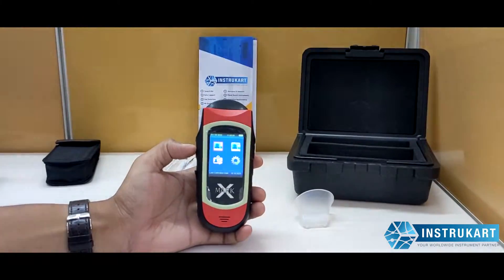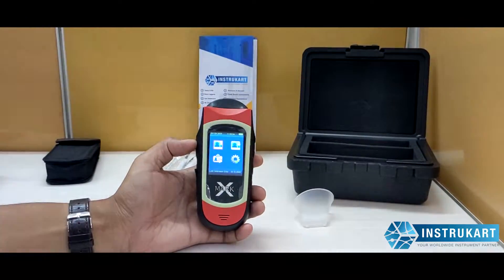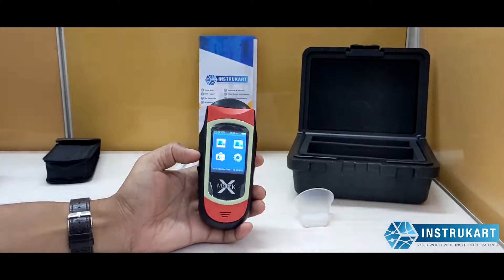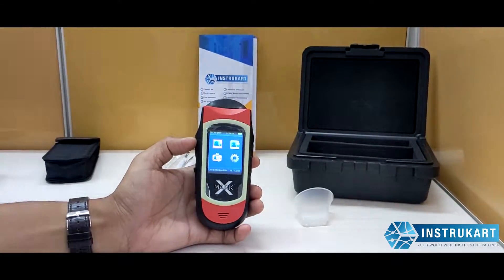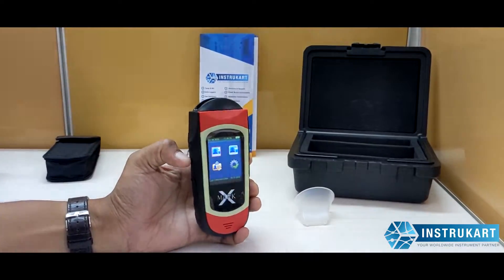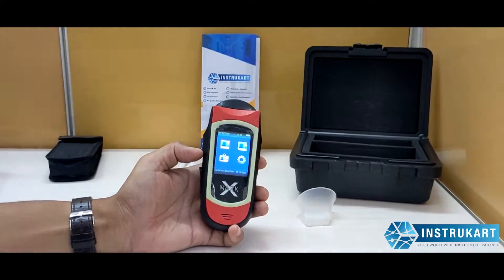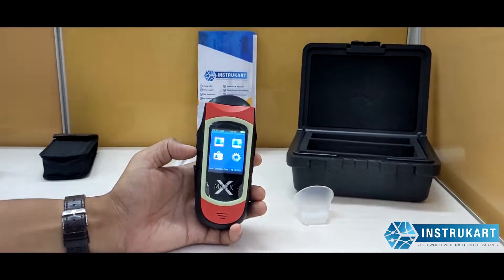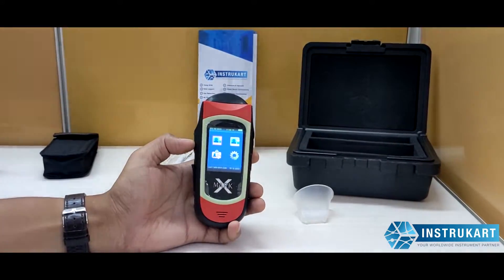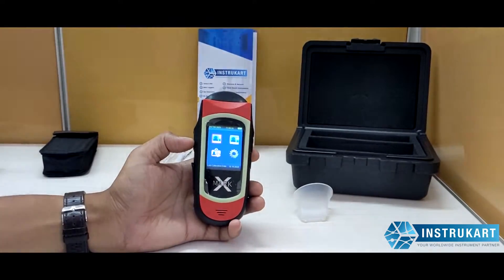Hello and welcome to Instrukart, your worldwide instrument partner. We have a breath analyzer tester, also called the Alcovisor Mark X with a thermal printer, model number WPT2. This breath analyzer is very well applicable for police departments, traffic checks, industries, airports, and any other related applications where you need to check the alcohol level of a person.